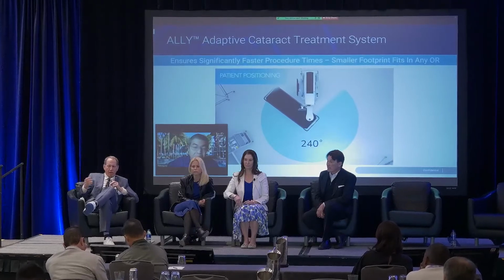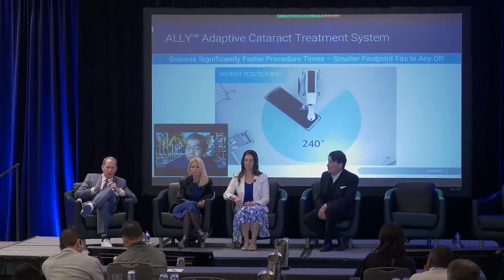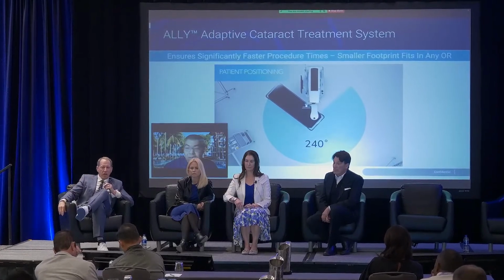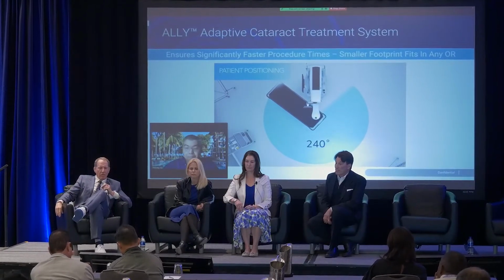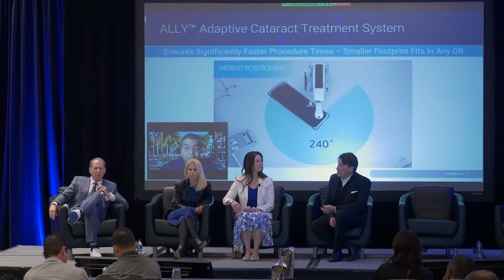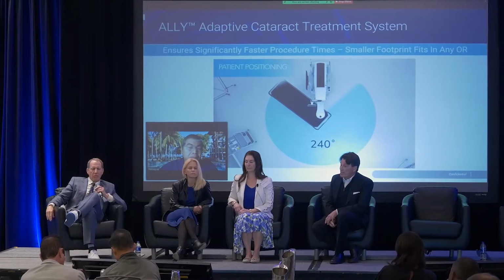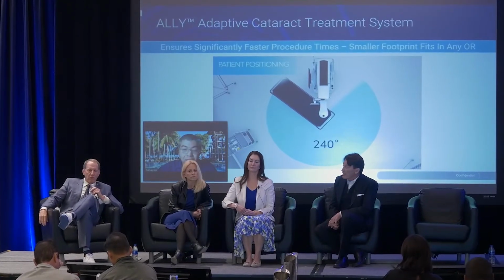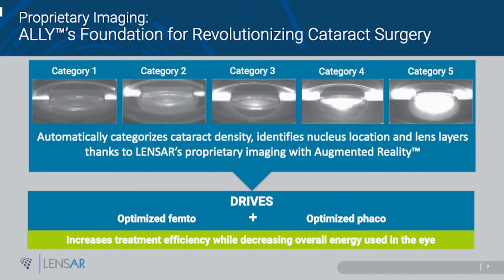But what you could also do, if you know you're going to come in the same direction every time, there'll be a way to bypass that most likely, so it becomes very automatic, because once you get it set up in your room, you're mostly going to be coming in from the same direction each time. But it is amenable to any positioning that you'd like it to have to these different angles approached. And like I said, it's a very small footprint, the size of a phaco machine, and it can be wheeled around to different positions in the OR if it's moved around from left eyes to right eyes. Just taking you through, you guys have seen this ad infinitum today about the different fragmentation patterns.